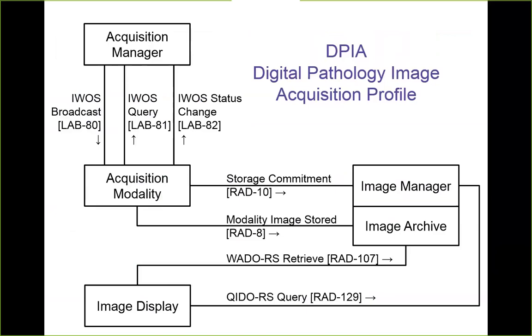At the same time, we can deal directly using existing radiology transactions with PAC systems, storage systems, vendor-neutral archives, and viewers to be able to see those images. Next slide.